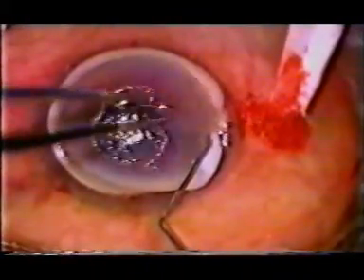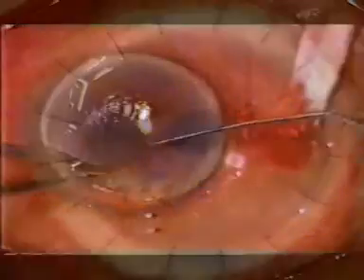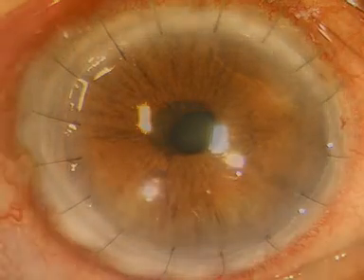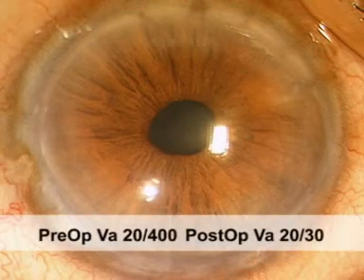The bevel of the graft was tucked into the peripheral pocket of the host, and the graft was sutured with interrupted 10-0 nylon sutures. At one-year post-operative follow-up, visual acuity improved to 20/30.